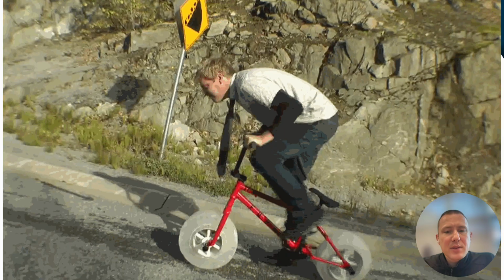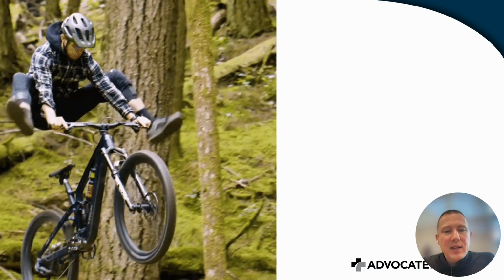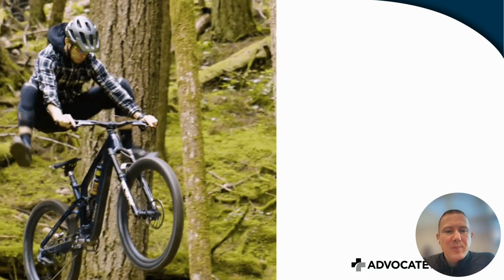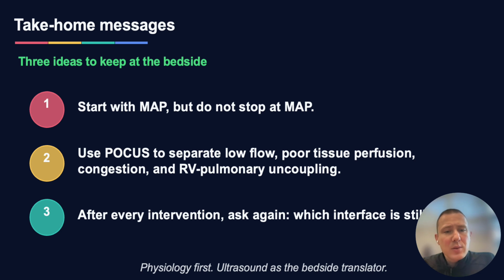So we went from this situation all the way to this. And the next day, perfusion improved, and the patient was discharged a week later. So take-home points. Start with mean arterial pressure, but don't stop at mean arterial pressure. If the MAP of your patient is normal, but you see signs of end organ dysfunction, like liver failure, the patient is not urinating, they're not mentating well, the lactic acid remains elevated, think of those interfaces and think which one is uncoupled.